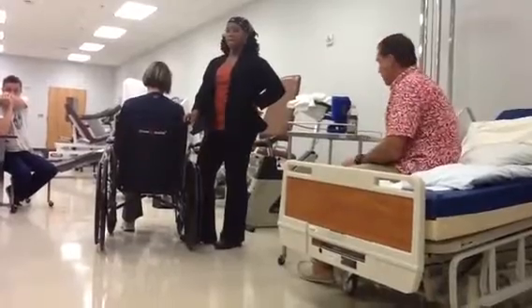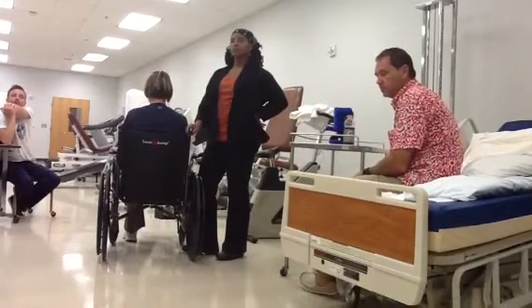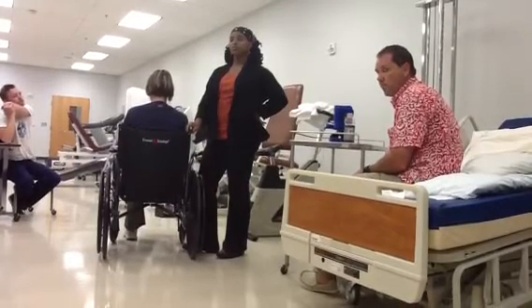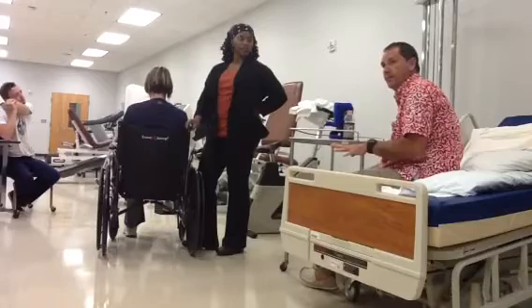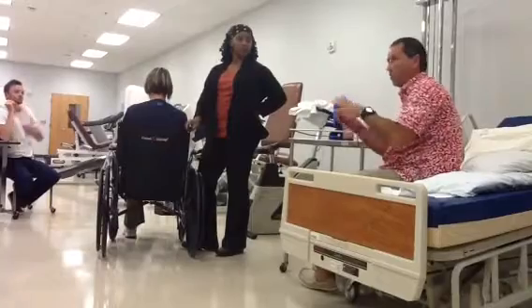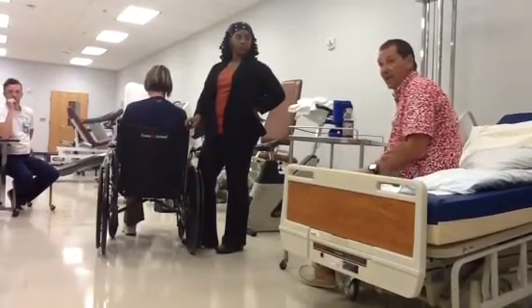So if you put the pillows underneath, are you worried then about the lower half? Because you said she had almost a perfect lower half position. Would you then be not as worried about the lower half? The perfect case scenario would be the ROHO cushion in here, whatever pressure relieving device she has, and a chunk over top of that, and her sitting in the chair, and everything would be great. If that's not going to happen, I want to protect her bottom. That's the primary concern: protection of that and getting proprioceptive feedback.